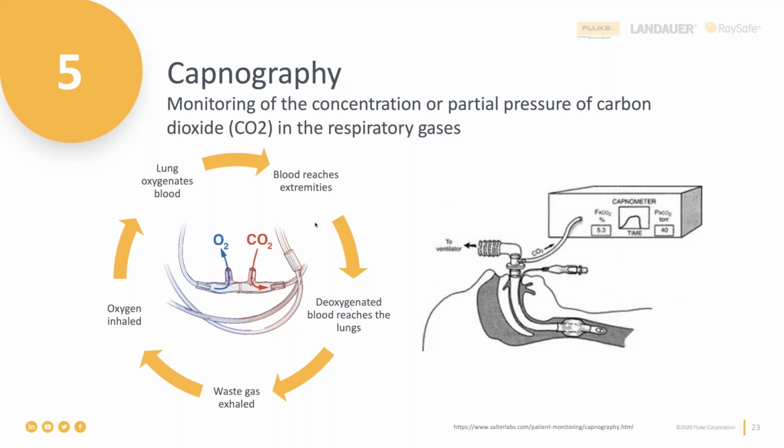Any changes in patient condition are going to be delayed on a pulse oximeter, since the blood needs to be pumped from the lung to the heart to the finger. End-tidal CO2 can be measured with each breath. And the device that measures this is a capnograph, which can be found in many patient monitors, normally in that ICU setting.